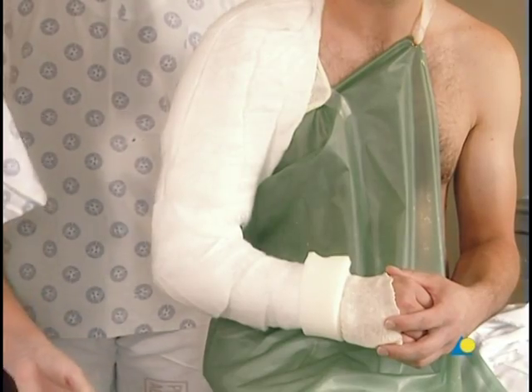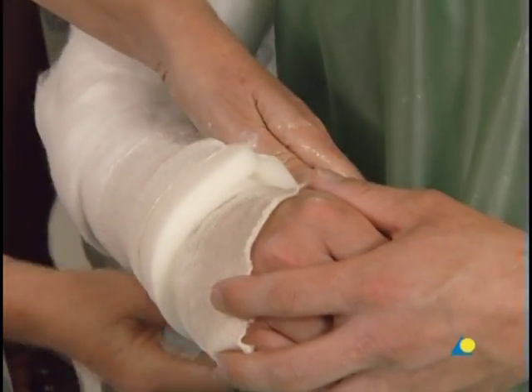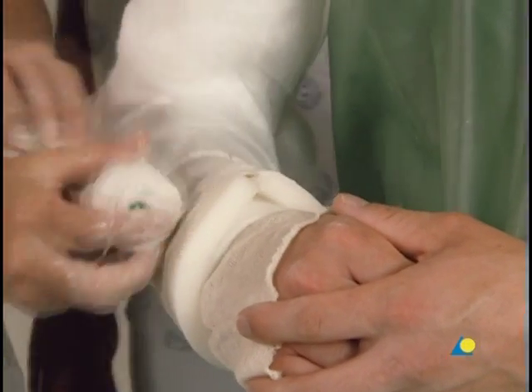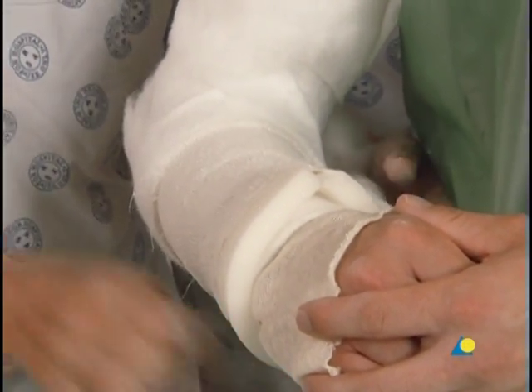The first plaster bandage is wettened. The excess water is removed by squeezing it. The bandage is applied beginning at the distal end, and then progressing towards the shoulder in the same manner as the cotton wool.